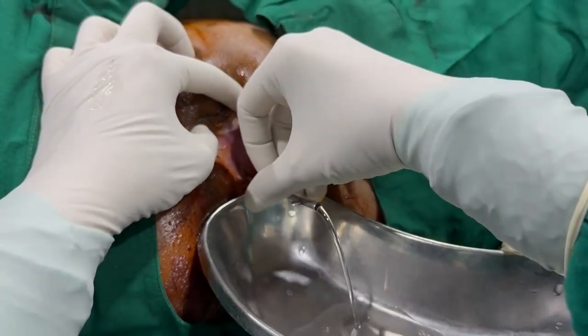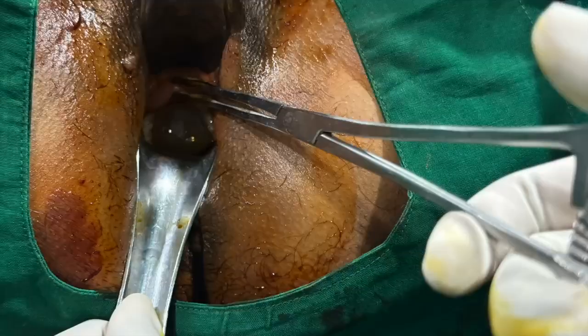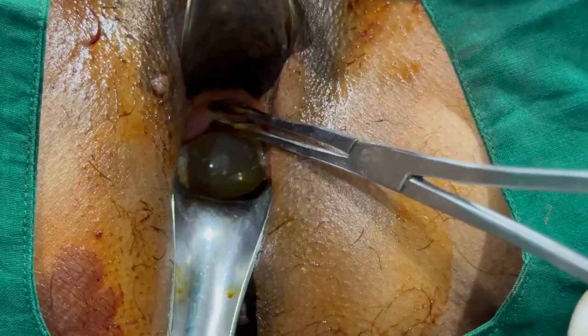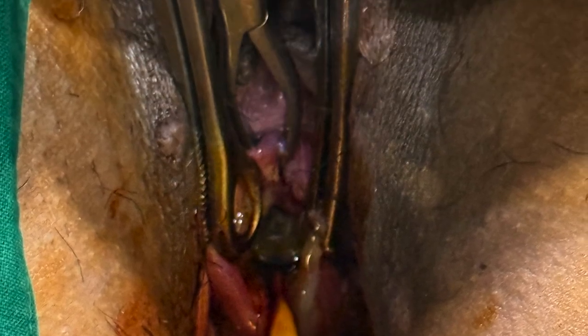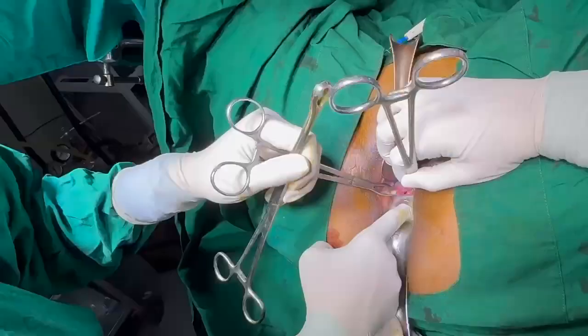Hello everyone. This is a case of emergency or rescue encerclage. This is a surgical procedure performed during pregnancy when there is acute risk of preterm labor or pregnancy loss. This is a condition when the cervix shortens and dilates and opens prematurely.